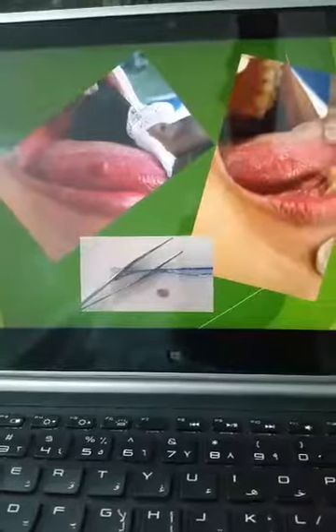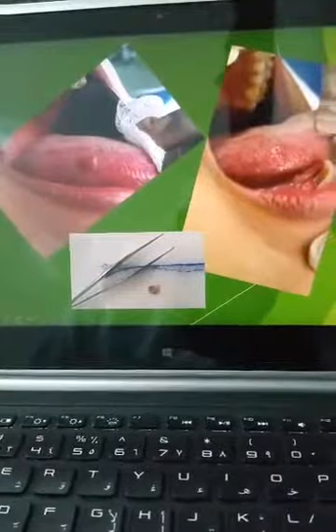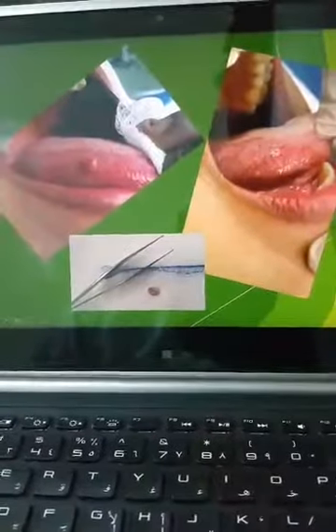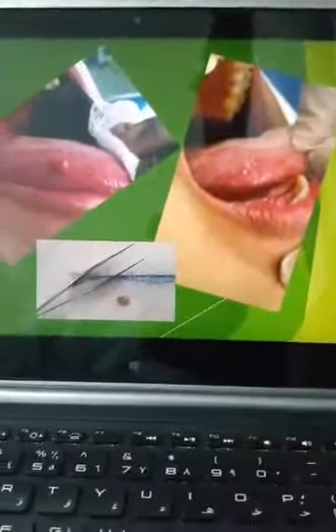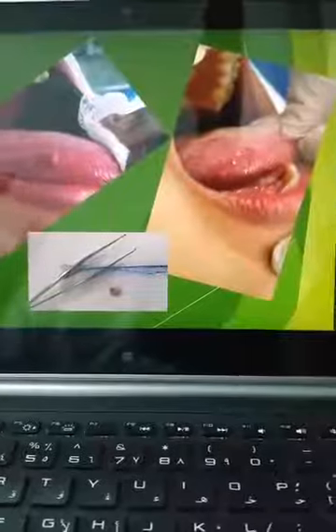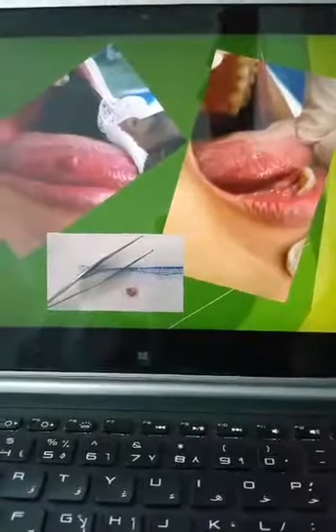I don't think there are any tools in dentistry today that can give you a very quick and less traumatic way to remove any kind of lesion, small or big, that can beat laser. Laser is the only tool that you can apply very easily to remove a small lesion. And if you can hardly see it here, this is immediately post-operative. This is exactly just a few seconds after we remove the lesion. And I doubt that with the knife you can do this without suture tearing and without bleeding. So here, we could say laser is very important today in our daily practice.